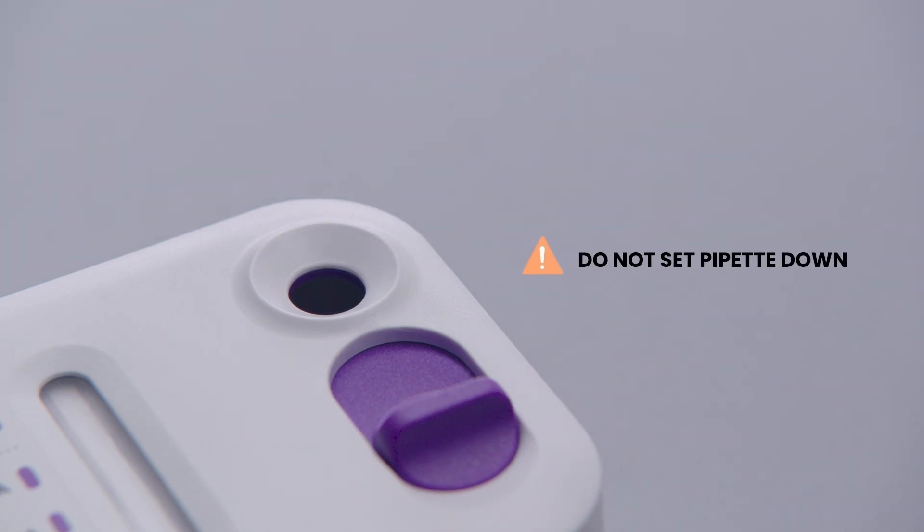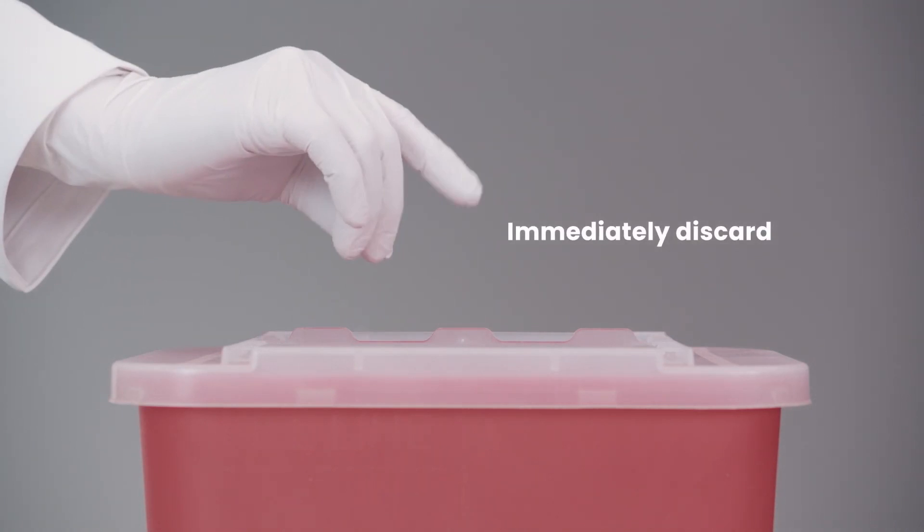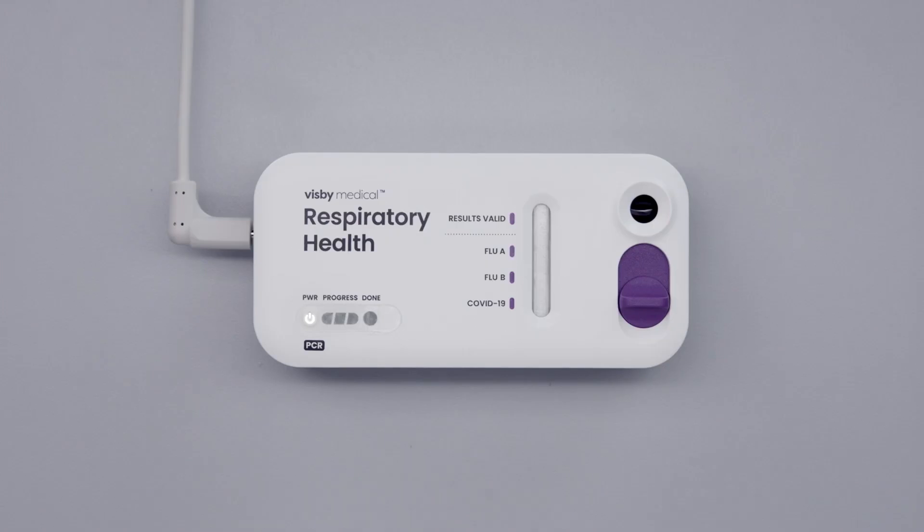Insert the pipette tip into the sample port and squeeze the upper bulb to add the fluid. Do not set the pipette down. Immediately discard it according to your institution's guidelines.